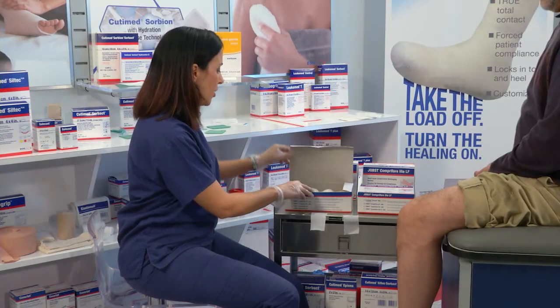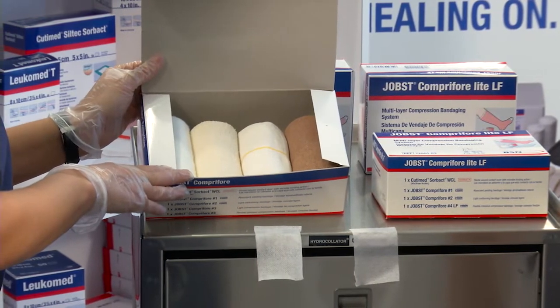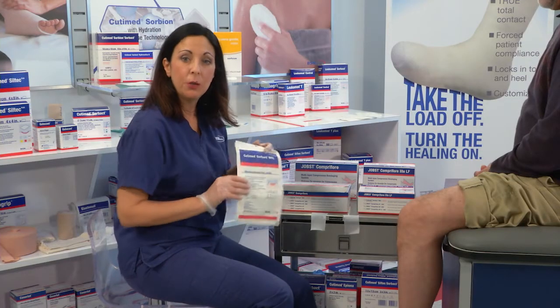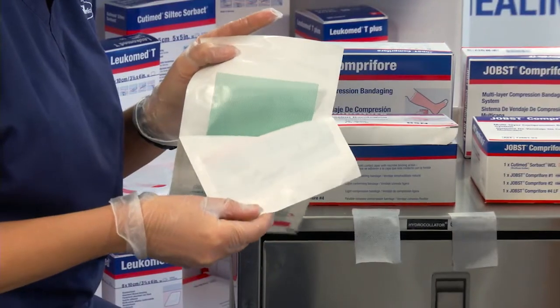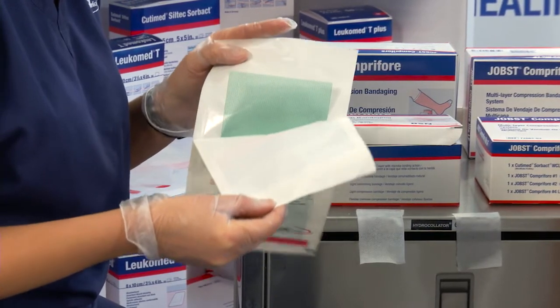When you open the box there are four layers and they're easily numbered. I've already removed them from the packaging for demonstration purposes. It also comes with Cutamed Sorbact as the wound contact layer. Cutamed Sorbact is a unique bacterial binding product used to remove bacteria from the wound. You would apply this to your wound first.